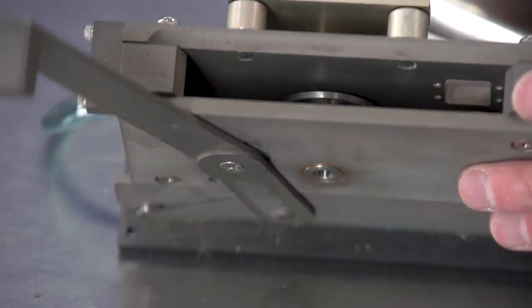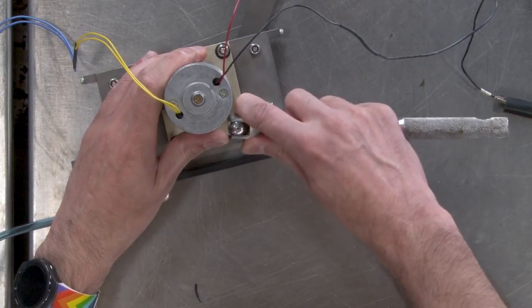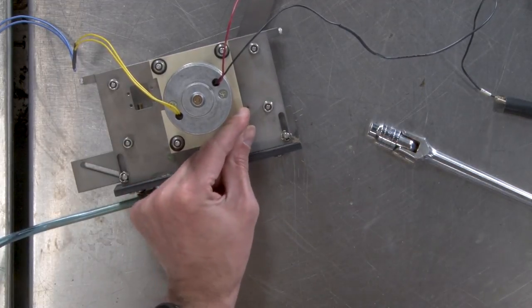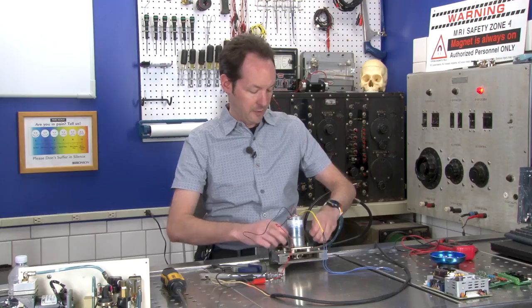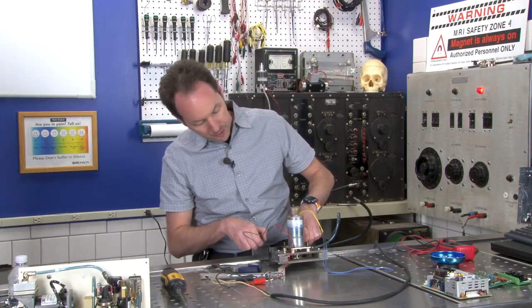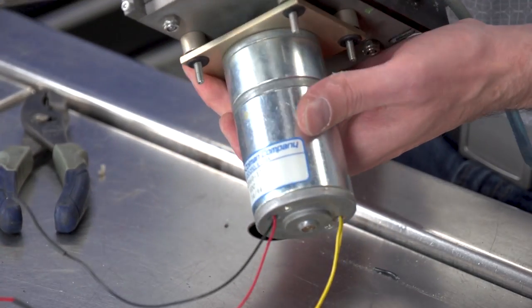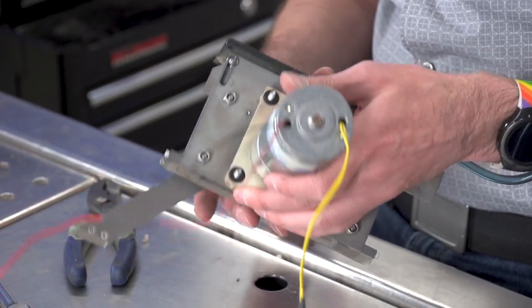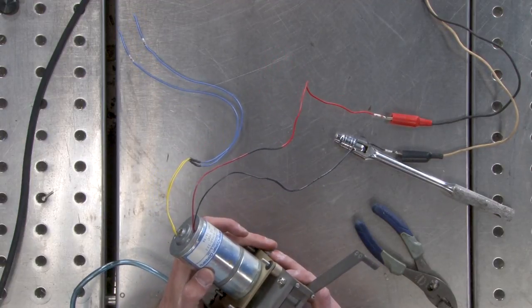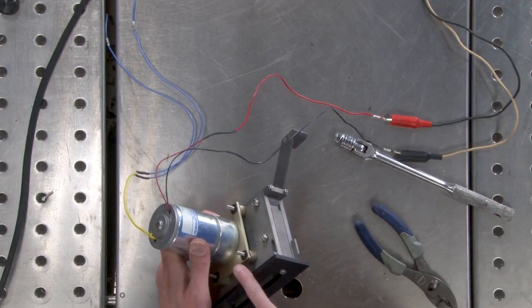Let's take this motor right off and check out the gear drive. I can turn it with my finger. The motor is on some little rubber isolation mounts, which are pretty nice. I've got to take a lot more apart to get that out — I've got to take this plate off to get the thing off, to get that thing off.